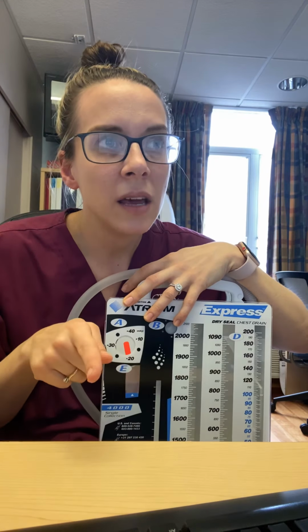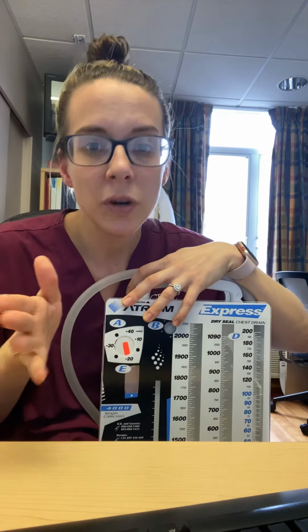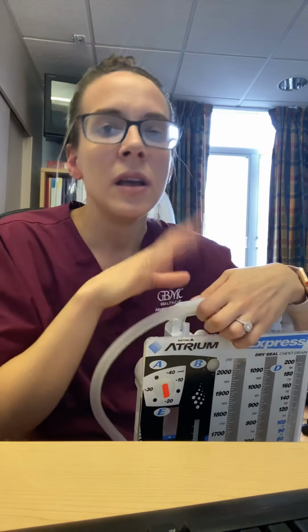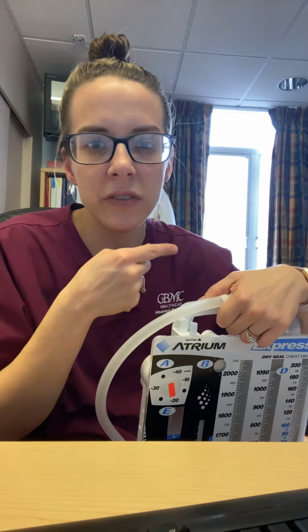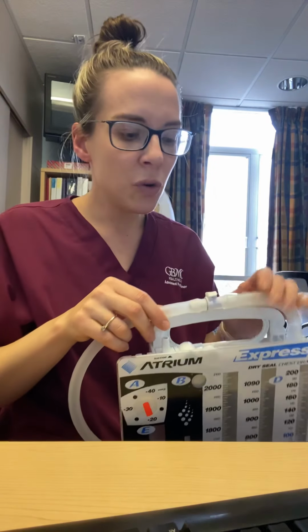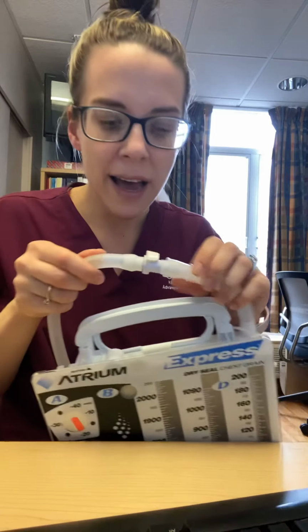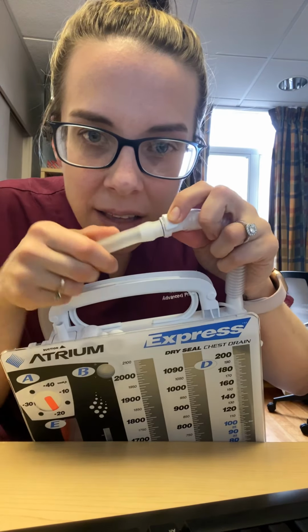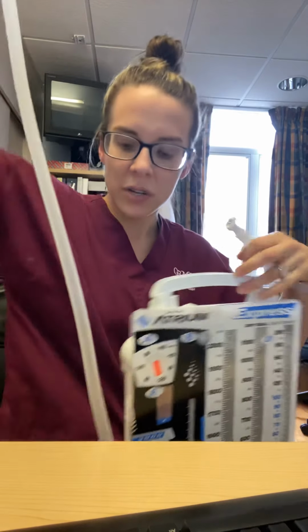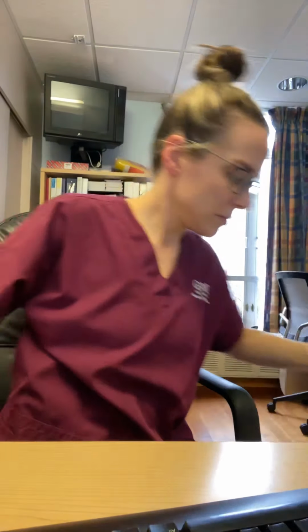Again, I haven't seen it used here. More commonly, or all the time, we're using the mini Atrium. You can research Heimlich valves on your own if you're interested. We do them at University of Maryland, but it's a kind of waste of time right now. For the mini Atrium, if you are switching somebody over to that, you unclick this little button here and disconnect. So now I've disconnected. I have my chest tube.